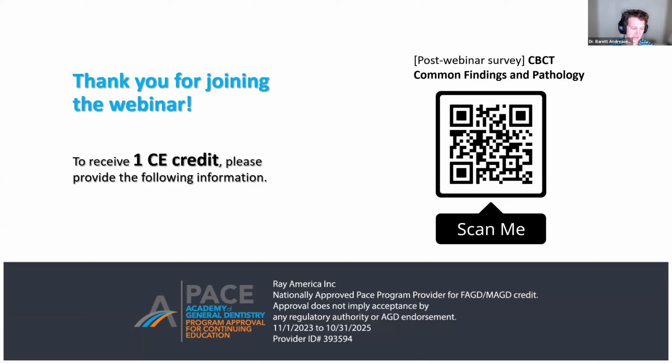But when we're doing follow-up imaging, it's always really important to have good quality scans because there's nothing worse than starting out with a poor scan, getting another poor scan 6 months later, and you can't tell anything anymore. So you always want to start off with a good CBCT machine, make sure you have good imaging, and we're going to talk more about image quality and what goes into that in our next meeting.